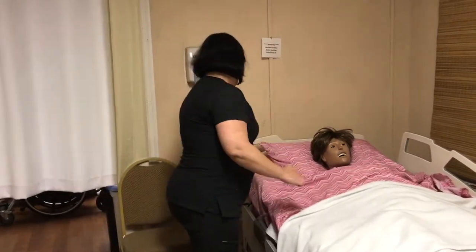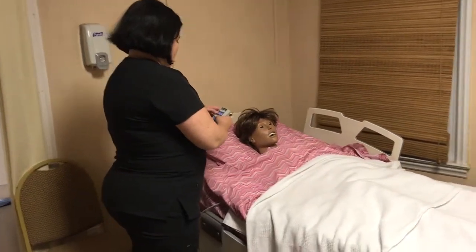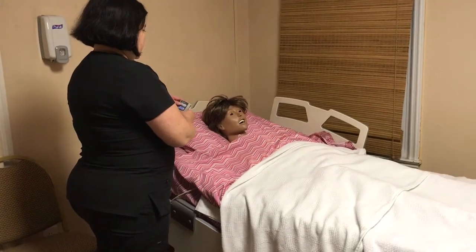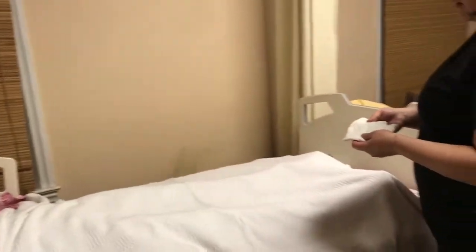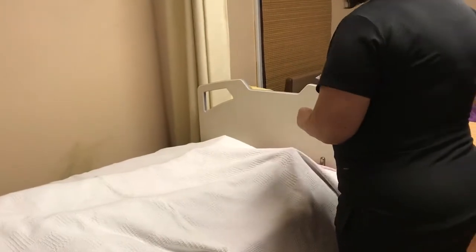We're going to adjust your bed to a comfortable working position, making sure that you are supine in your bed. According to your care plan, you wear a large knee-high stocking that's been measured by the nurse by the circumference of your calf.